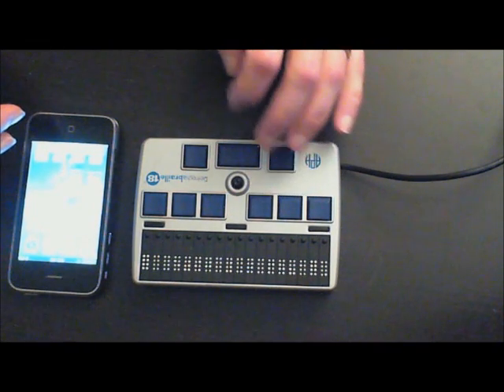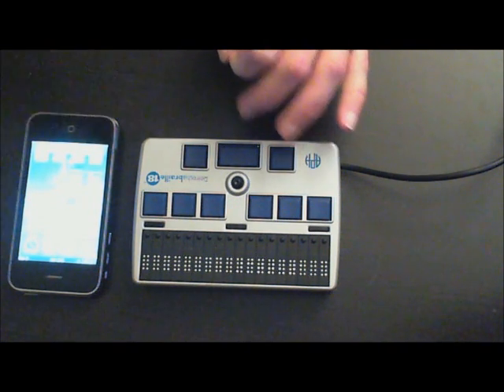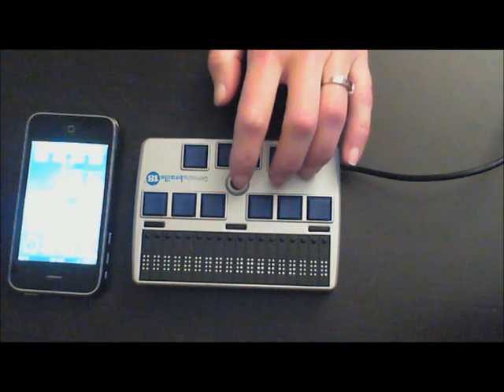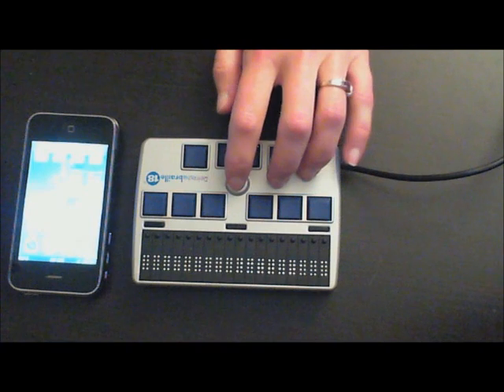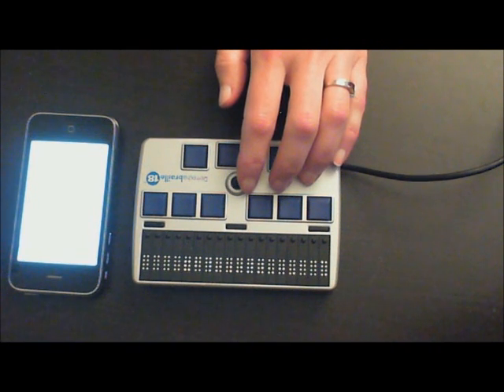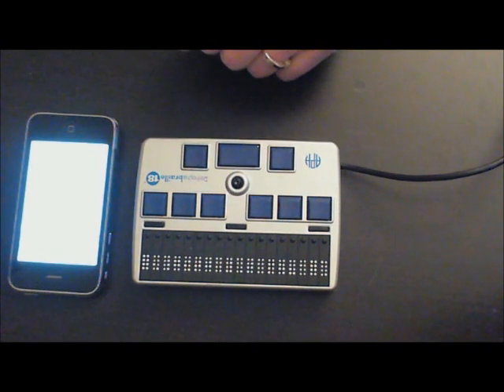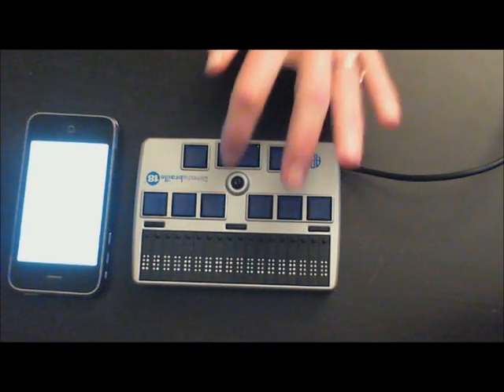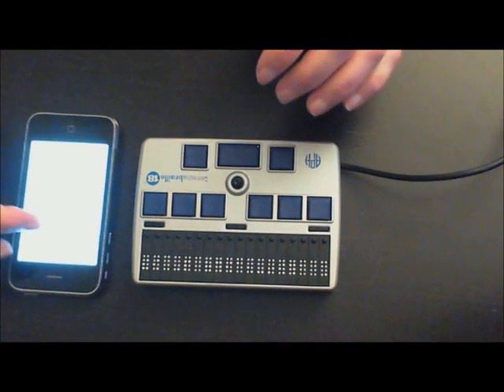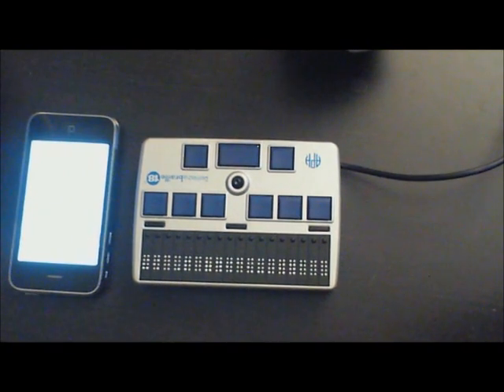I'm going to take you into Settings so I can show you the basics of what you want to turn on in order to make this iPhone available to you so you can use it independently all the time. I'm going to press straight down on the joystick to open Settings. We're going to move through our Accessibility settings by pressing the joystick to the right. The first thing you want to do is turn on VoiceOver. VoiceOver is what is actually controlling the Braille display, along with your Bluetooth and your Braille contractions.